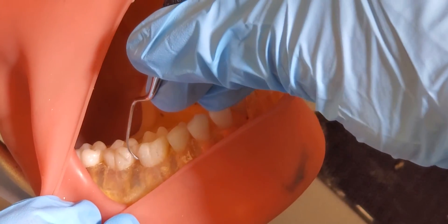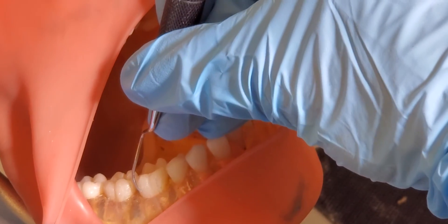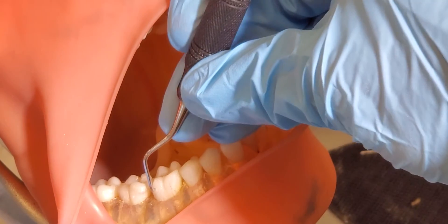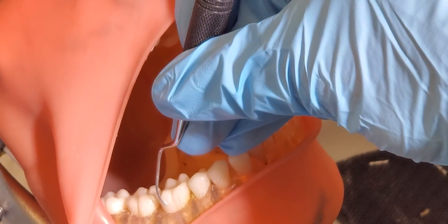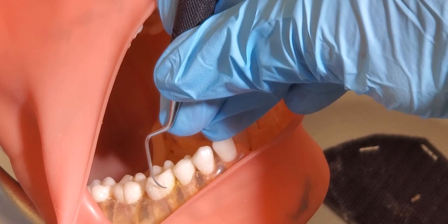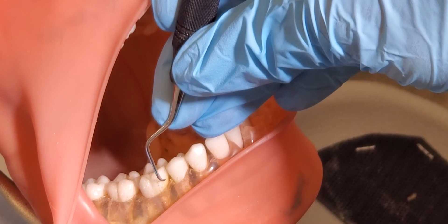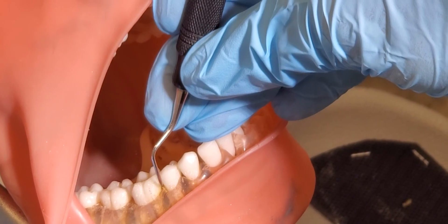Again, with this instrument, we want to make sure that we're on the tip third — not the middle third, the heel third, or even just on the straight tip. We're going to start on the tip third, and then as we're going around, it stays pretty flat until about right here at the line angle. Then we're going to have to start rolling a lot more as we go in approximately like that — you can see a lot more rolling right there.